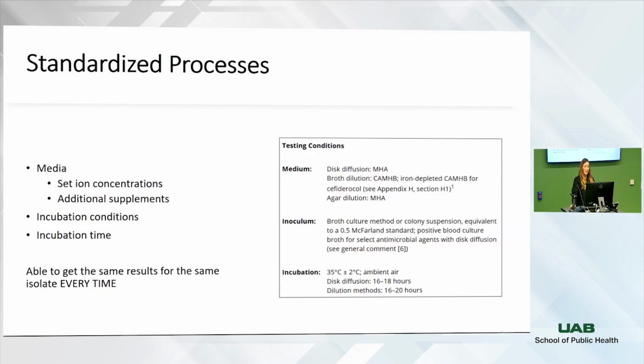And then we all incubate under the same exact conditions to allow the most effective antimicrobial usage to occur within that given setting. We know our organisms should grow when we do it like this. And then we also get a lot of reproducibility in these situations. So we are able to get the same result for the same isolate over and over and over again.